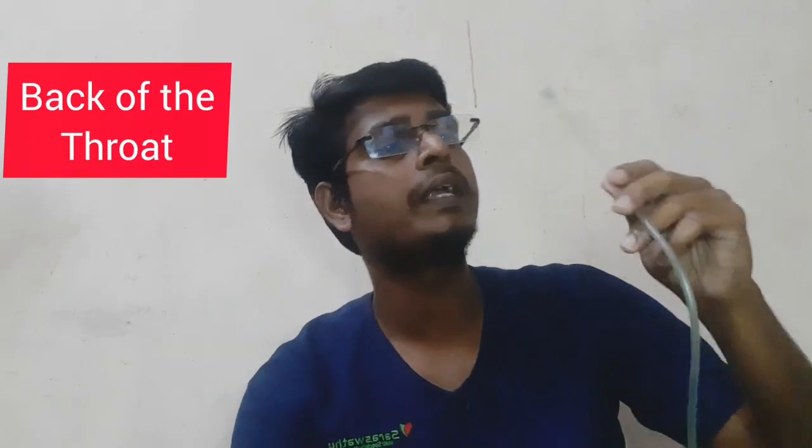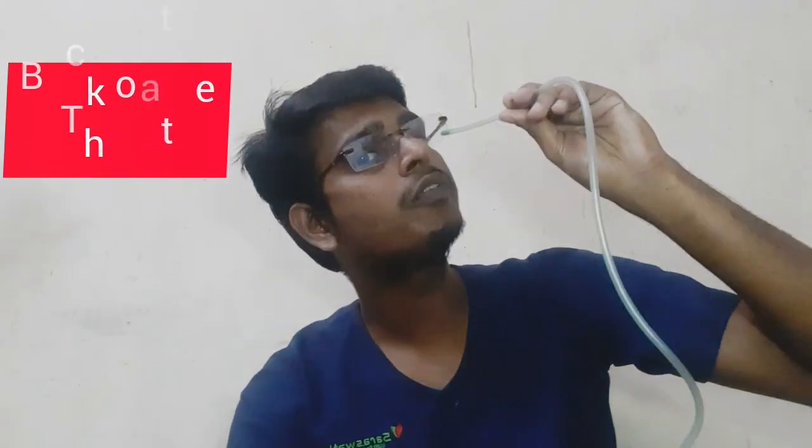Position the patient in sitting or semi-Fowler's position. In supine position, the tube may enter the airway. In sitting or semi-Fowler's position, insertion is safer. We insert the tube through the nose first, passing it down to the throat.